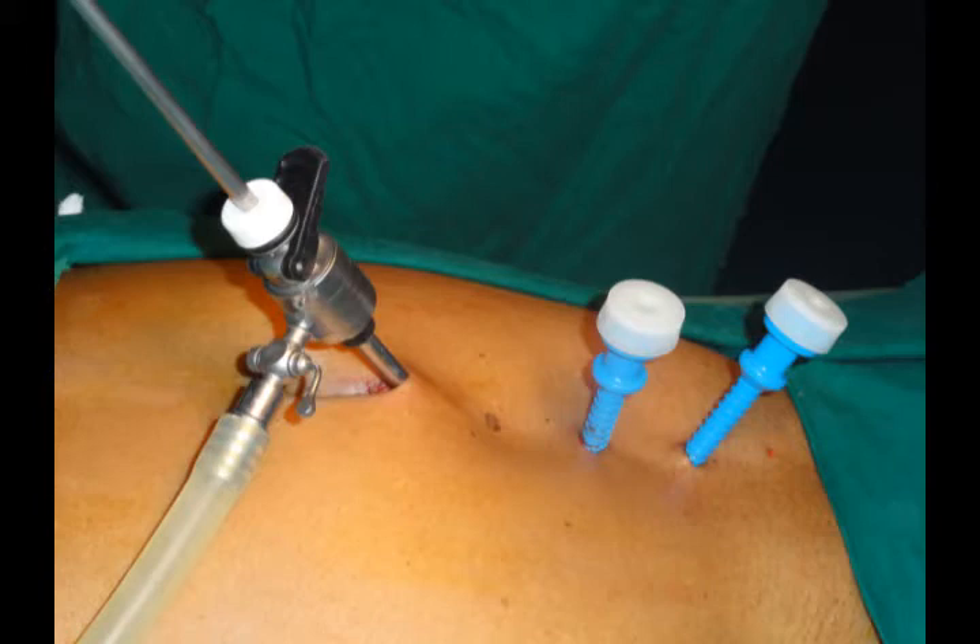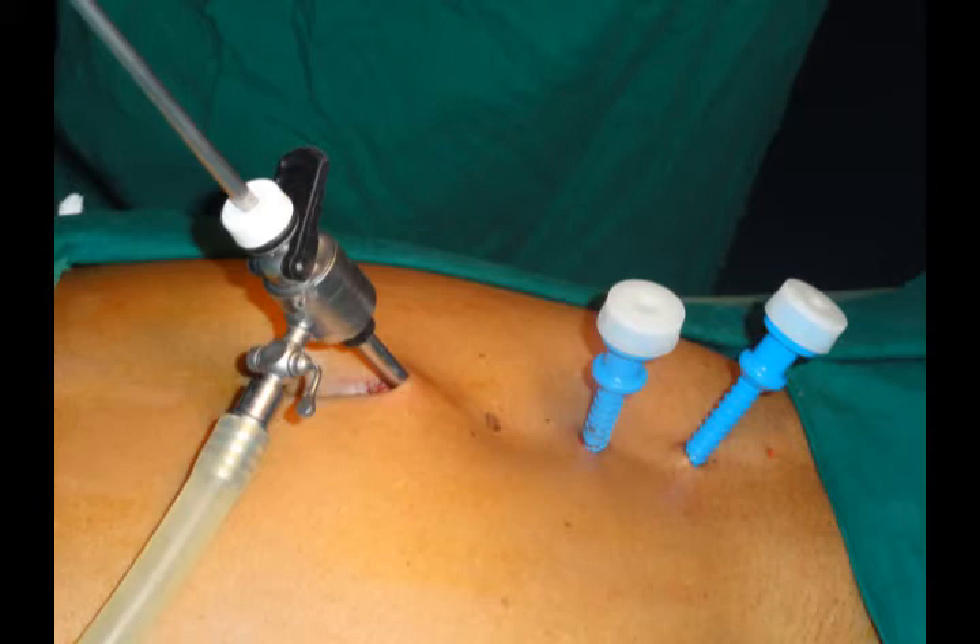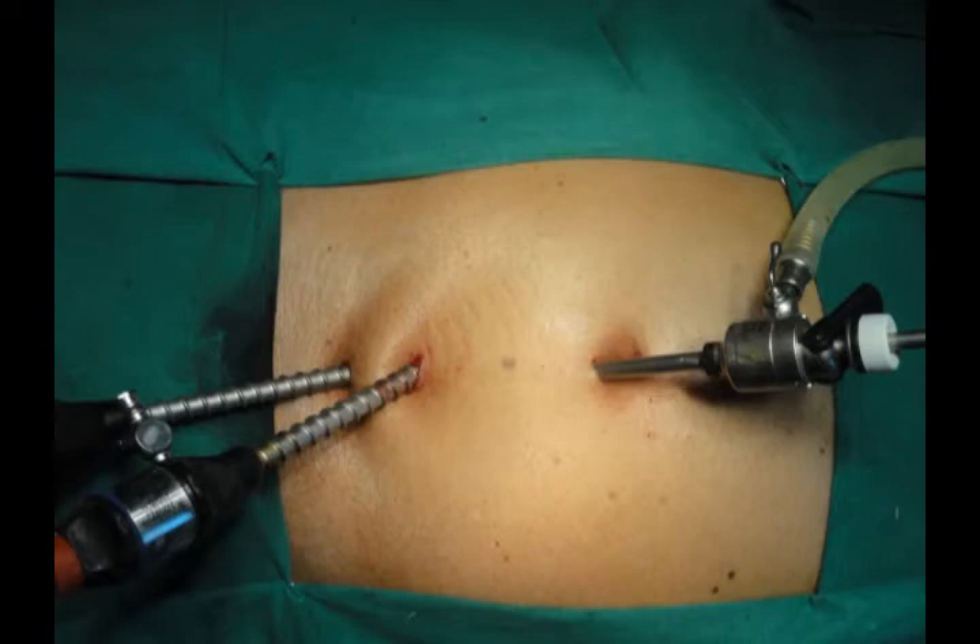The metal one is the camera port; the other two are the trocar ports for the operating ports in the midline — three metal trocars. Two spiral 5 mm trocars serve as the operating ports: the suprapubic and the middle one, with the top one for the camera. The lower-most suprapubic port is replaced with a 10 mm port for insertion of the mesh.